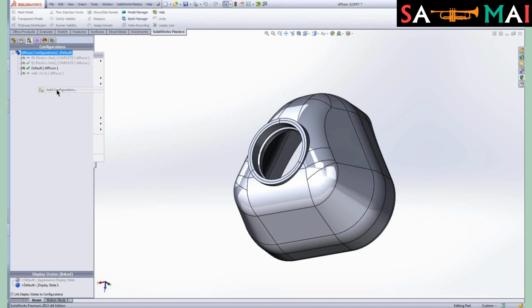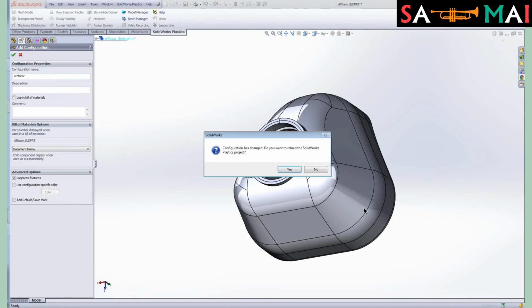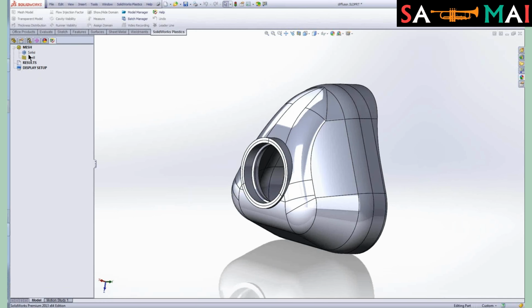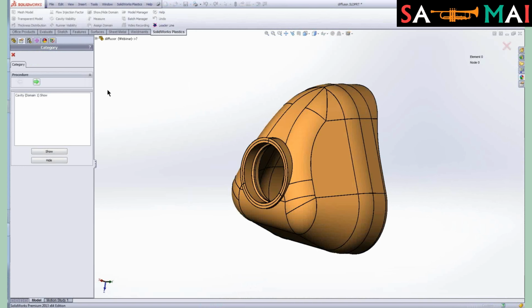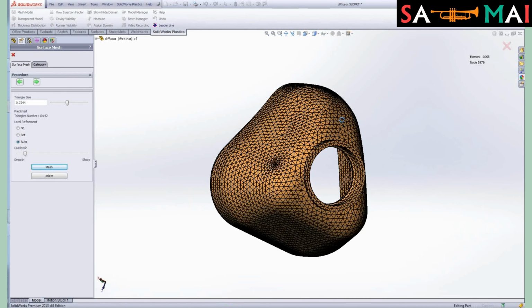We'll add a new configuration. Start a new plastics project. And we'll go ahead and do this with shell mesh since it will run slightly faster than doing a solid element. So we'll just go ahead and accept a couple of defaults here. Make sure we get a decent representation of the volume of the part.